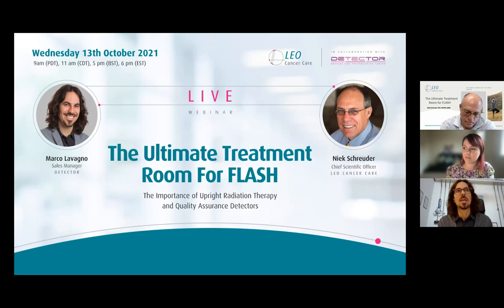About the front end electronics, I'm pretty sure a lot of radiation tests were carried out during the development of the front end electronics, the one next to the ionization chamber. Then of course the spread of neutrons is 360 degrees all around, so it's something that you cannot prevent. But in principle, at the moment, we are just thinking about several shieldings, and from the experience with the conventional rates, we didn't have issues in the past, let's say.